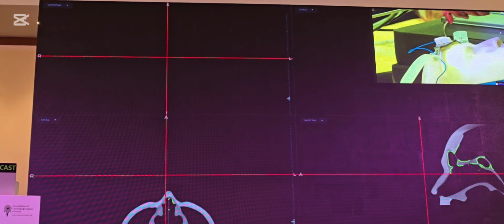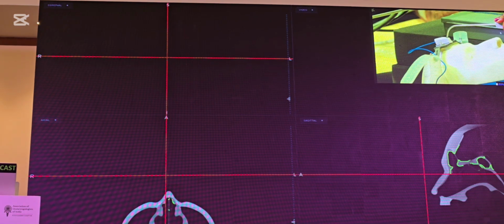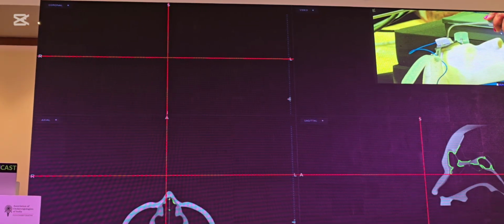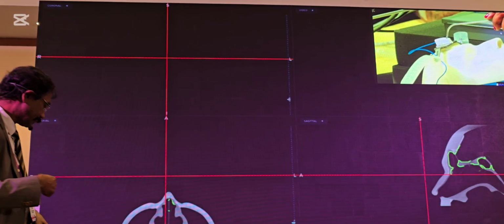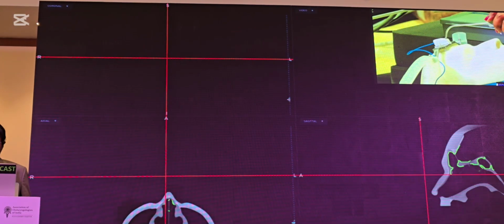Yes. Near. Can you see that? So when you register with the 70-degree curve section, you will be able to see that it's being detected, and then when you introduce that, the system will be able to recognize that you are introducing the curve section, and it will know the distance between the device and the tip. Can I have this presentation?